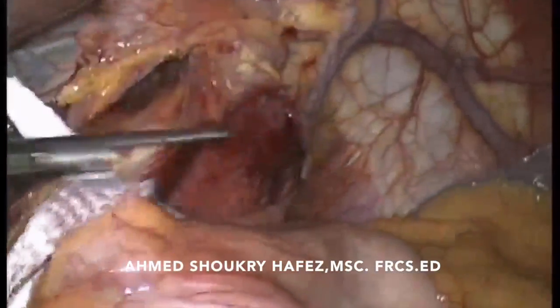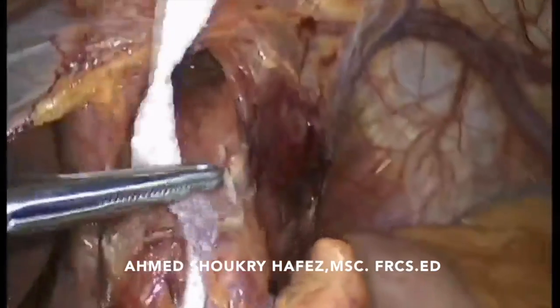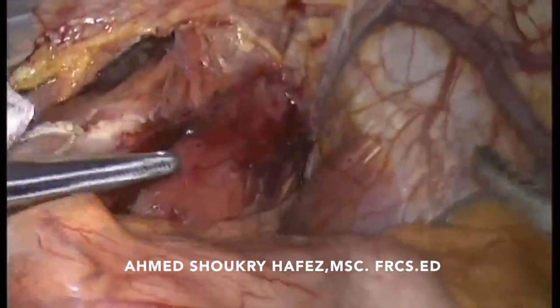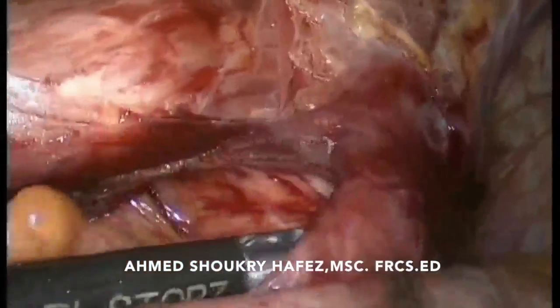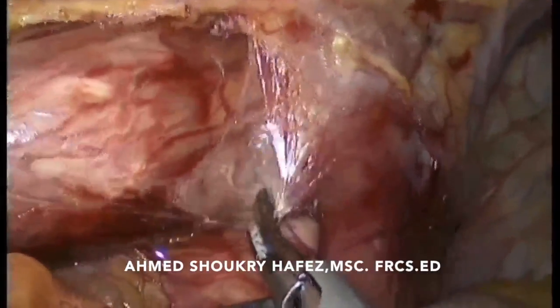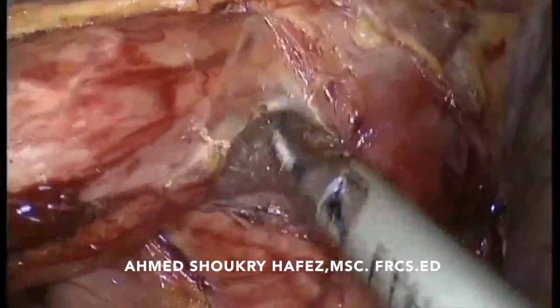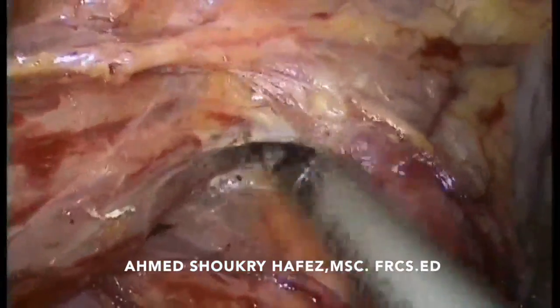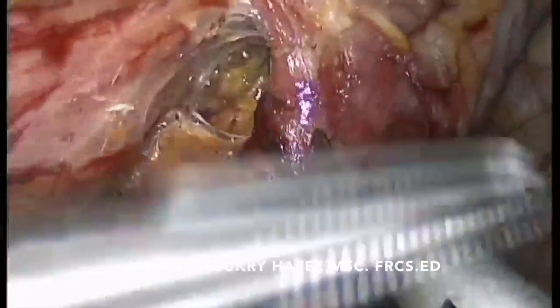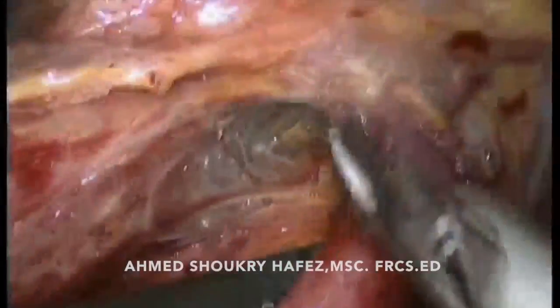The assistant now, coming from the left subcostal port, is the one who is pulling on the esophagus in different directions as the dissection is carried out. All attachments of the esophagus up to the level of the inferior pulmonary vein in the chest will be taken down to mobilize the esophagus very nicely into the abdomen. This is a key point in this surgery.